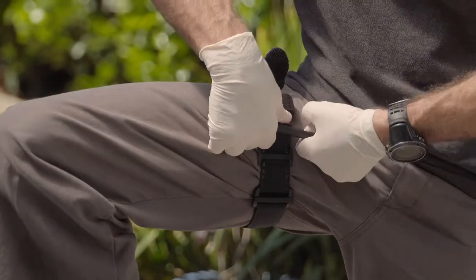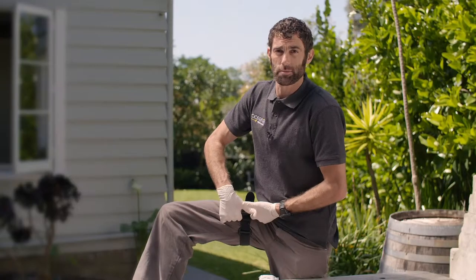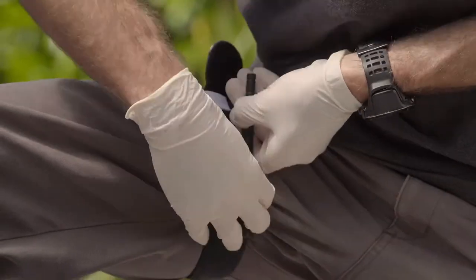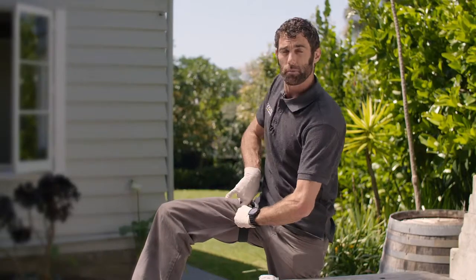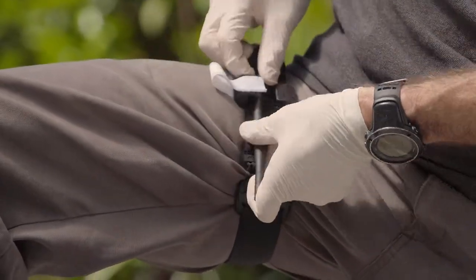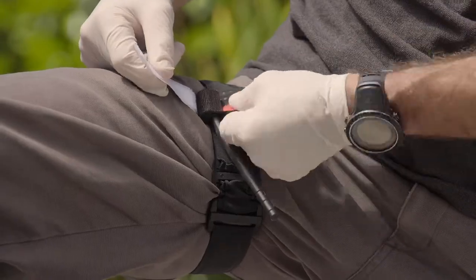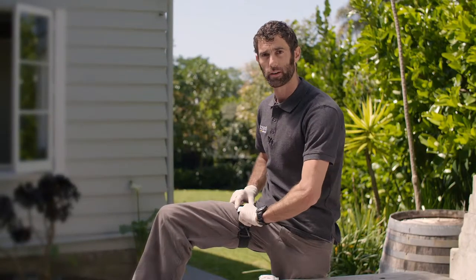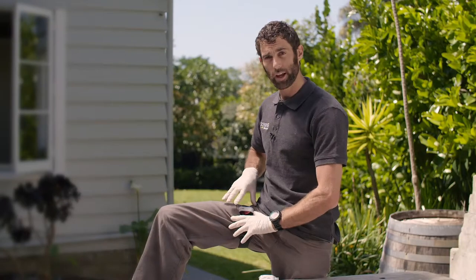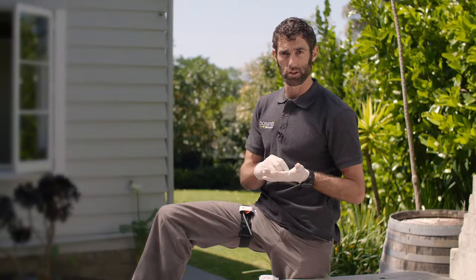The torsion bar needs to be tightened multiple times until bleeding stops — on a leg especially, that means grabbing it, pulling it and tightening it. It's going to end up very tight and can be very painful, but is required to stop a bleed. Keep going until the bleed is completely stopped. To secure it, place it into the holder and secure it using the strap through it and then the Velcro over the top. Write the time directly onto the tourniquet and ensure it is not covered so it can be seen when you evacuate — it's also added to the patient's notes.